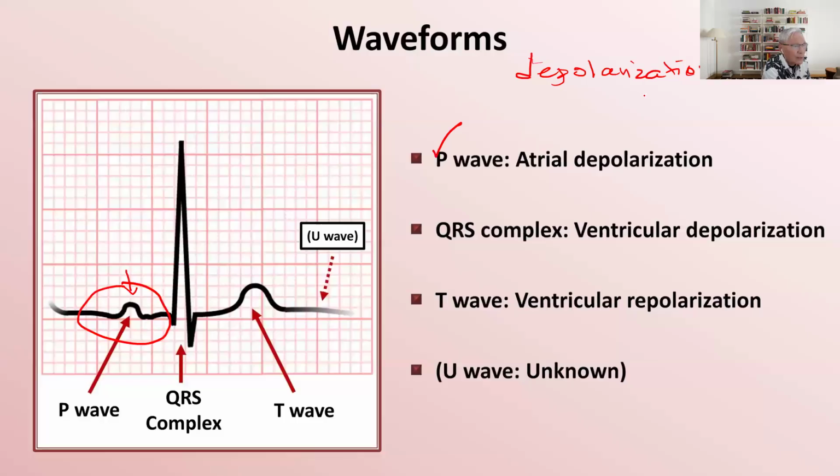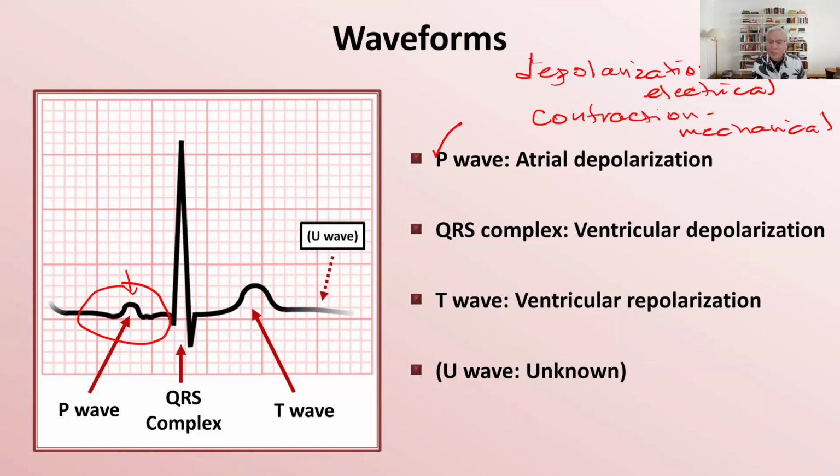And this is going to be the one that is recorded in the electrocardiogram. Contraction is a mechanical event. Okay, just because you see waveforms in the electrocardiogram, for example, doesn't mean to say that the patient is alive. They could have normal waveforms, but they could be dead, right?